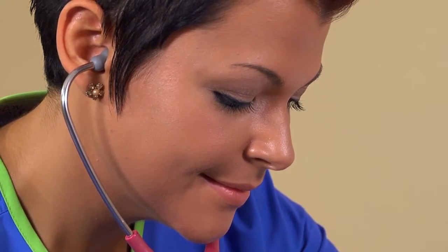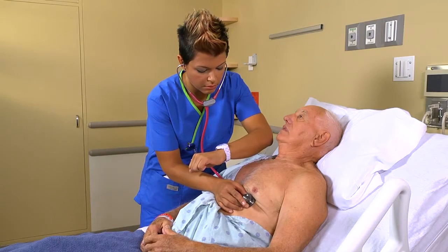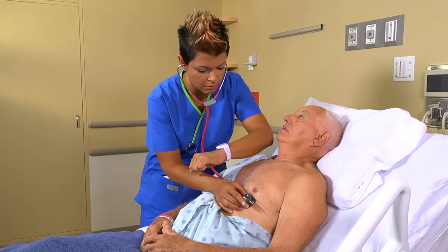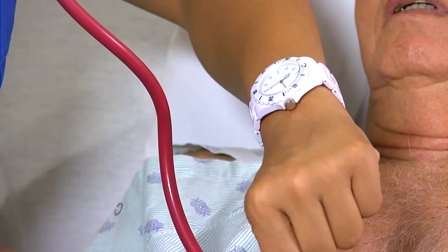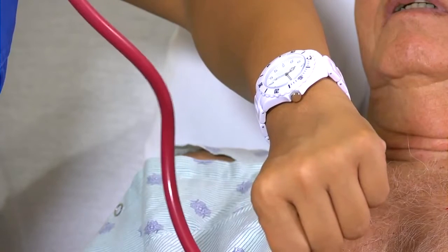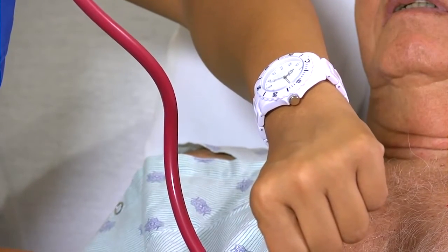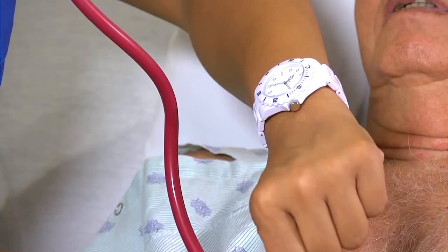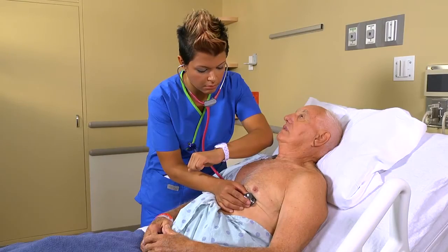Once you can hear S1 and S2 with regularity, look at your watch. When the second hand reaches a number on the dial, or when the digital display reaches a round number, begin taking the apical pulse, counting the first beat you hear as 1.